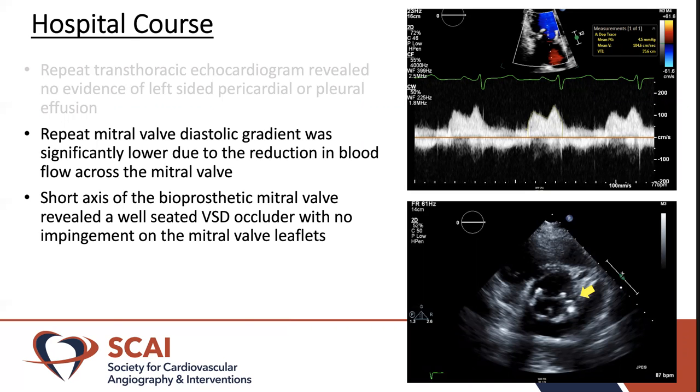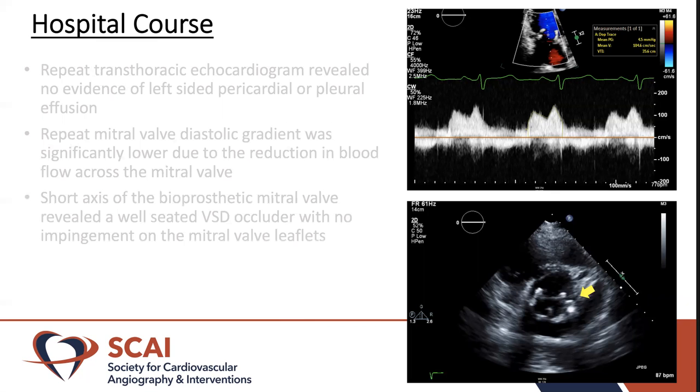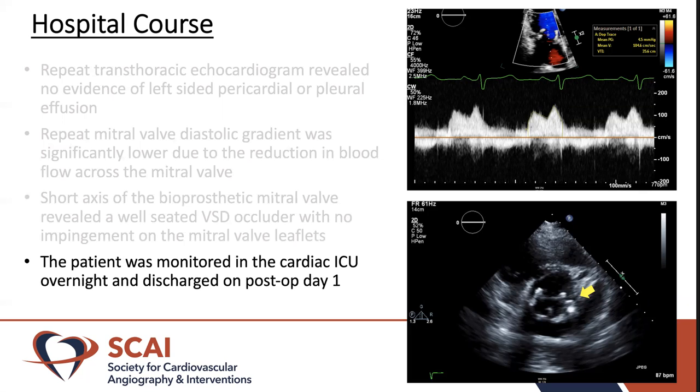On the short axis images, we actually saw that the bioprosthetic mitral valve leaflets did not appear impinged by the VSD occluder, and the VSD occluder appeared well seated without color flow across it. At this point, the patient stayed overnight for monitoring in the cardiac ICU and was able to be discharged on post-op day 1.